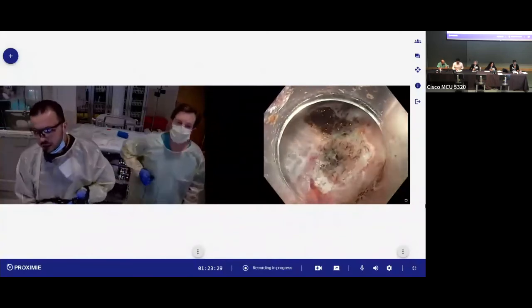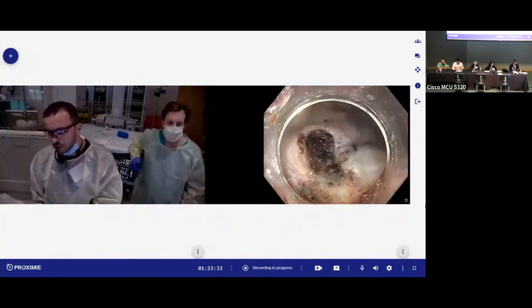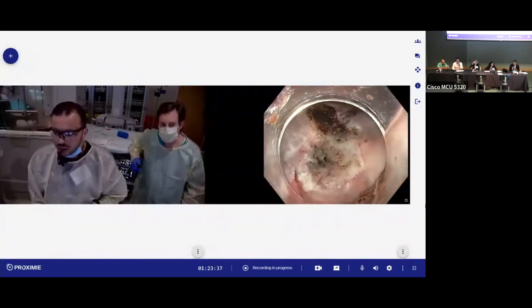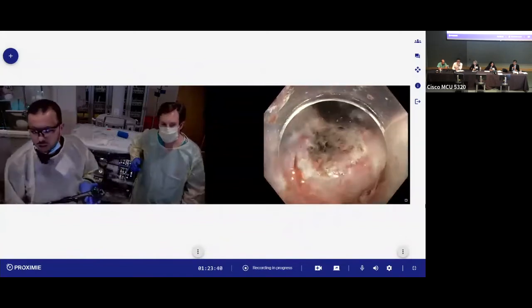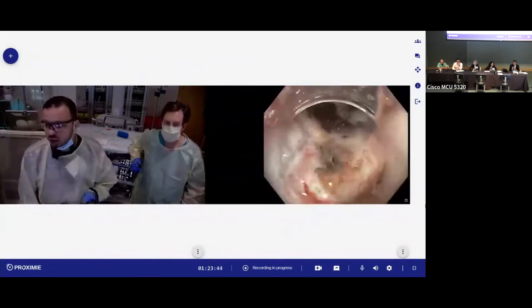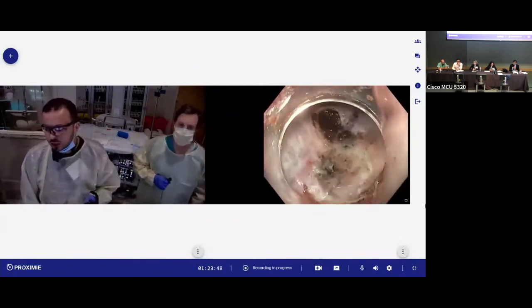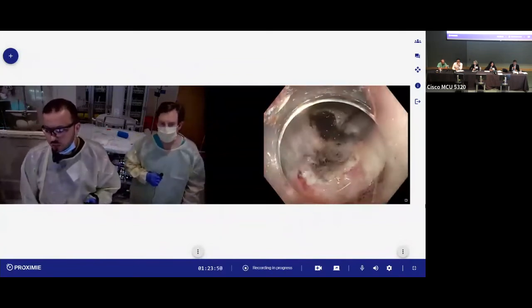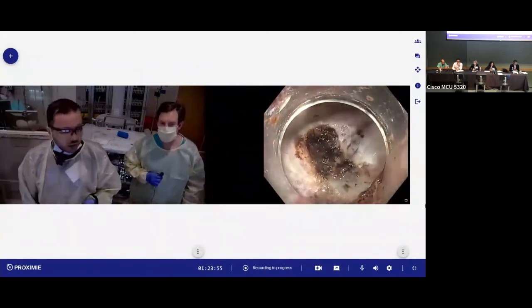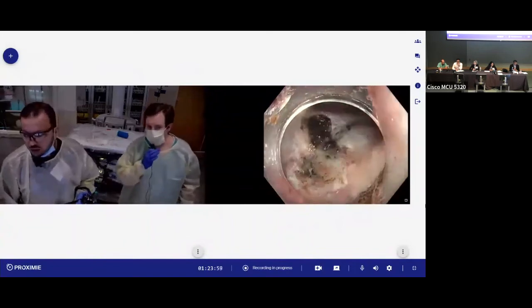Yeah, I mean, for any piecemeal resection, generally 3 to 6 months is our approach, and that's what we will do for this patient. These patients become really hard to close with clipping because of the fibrosis. And I think the best thing would be just to get some good hemostasis and leave it without any further clipping. Any thoughts, Jeff?